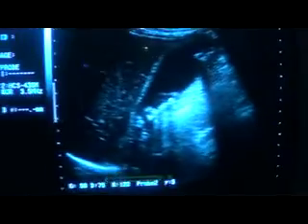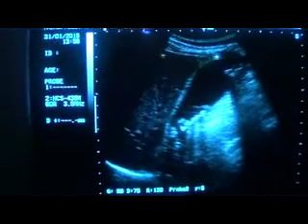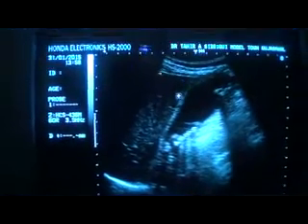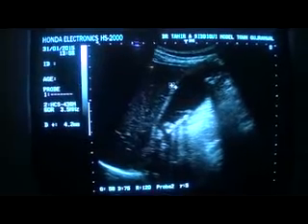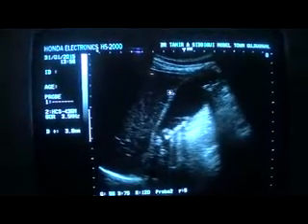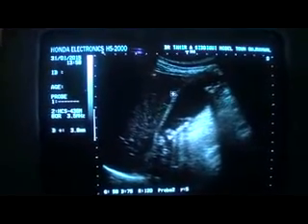And again, I am going to ask the patient to take a deep breath and hold it. Take a long breath and hold it. So the first thing that I noticed is that there is a change in the position of the calculi, and this is the gallbladder wall. Now you see that even the gallbladder wall is not appearing as thick as it was in supine posture, something around 3.8, which is normal.